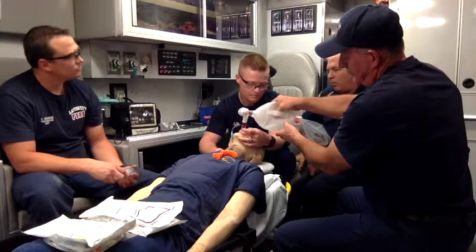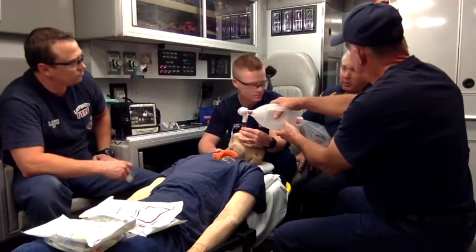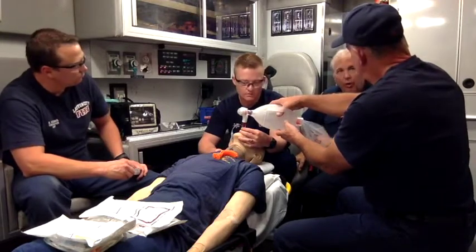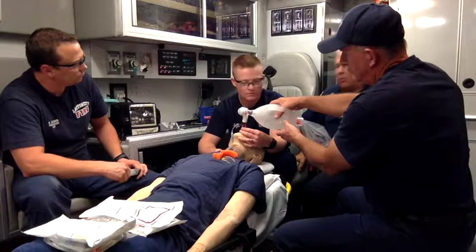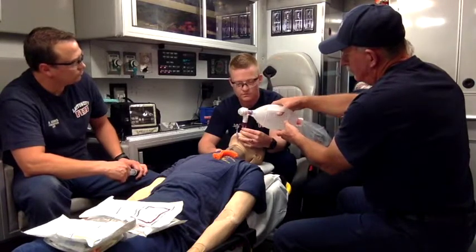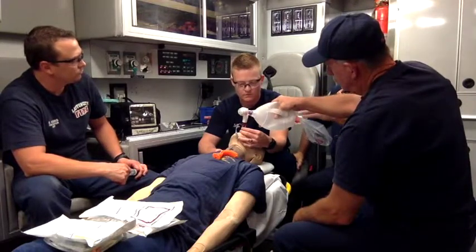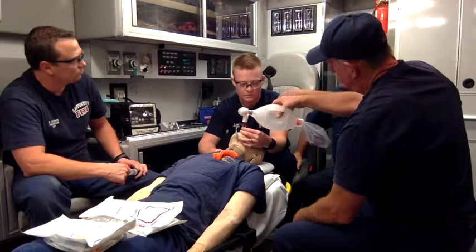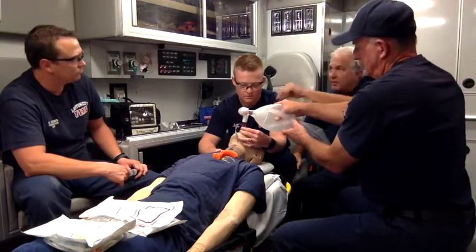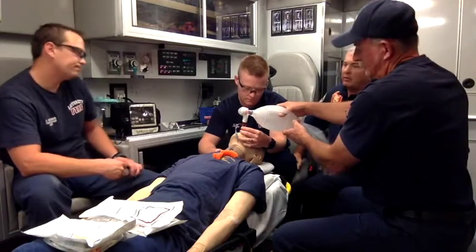So I will tell you more and more, I hammer people about this. I was down at UVU teaching the new medics the other day, and I hammer people about don't lose that tube. So I jokingly say we should be able to pick this patient up by the tube and walk them in, holding on to the tube. So if you end up twill taping that, and then taping it again, and Mark Hoyt pulls out his tape and chevrons that thing on there or whatever it takes, it's so super important that we not lose that tube.